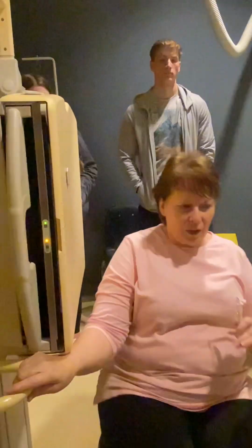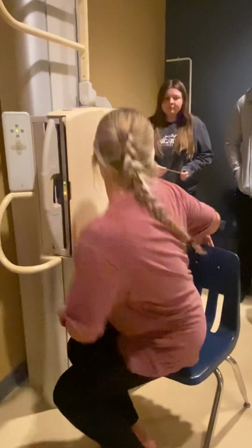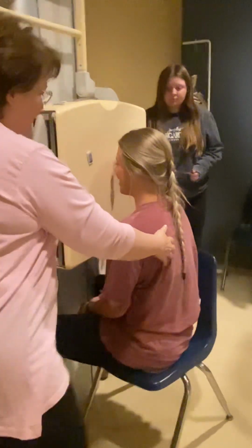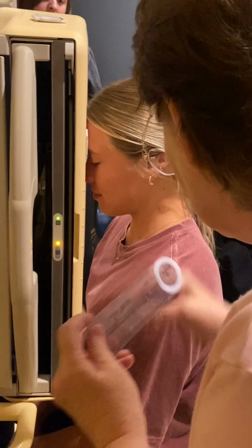So, all right. Back to, all right, Natasha, I have you. All right, so what I'm going to have you do, get on each side of this, scooch way up, and even more into the board. Yep. All right, and then, there you go. All right, now I'm going to line up the OML.